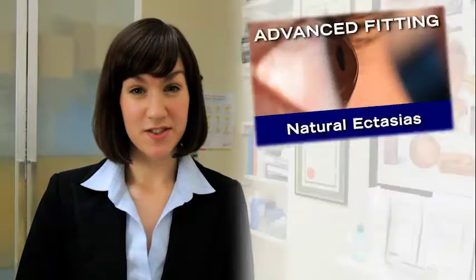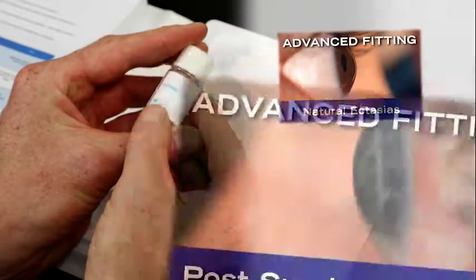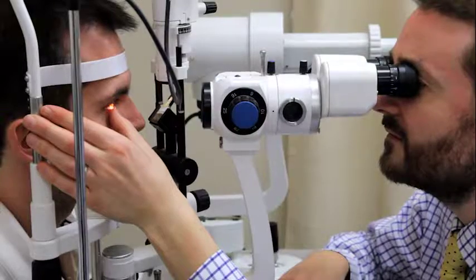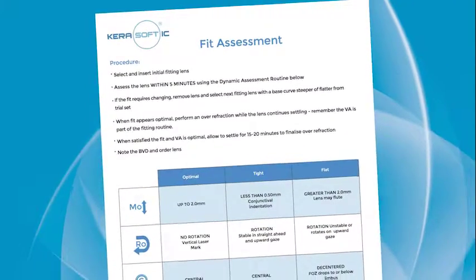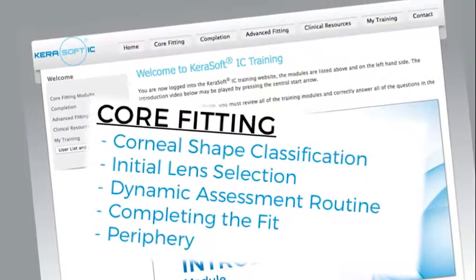This module shows you how to fit more complex natural ectasias using lens designs outside the range of the diagnostic set. Post-surgical fittings are described in the next module in this section. Identifying the corneal shape from clinical measurements and topography is important when fitting these cases, as well as a sound grasp of the fitting methods described so far. You must complete the core fitting modules before you work through this section.